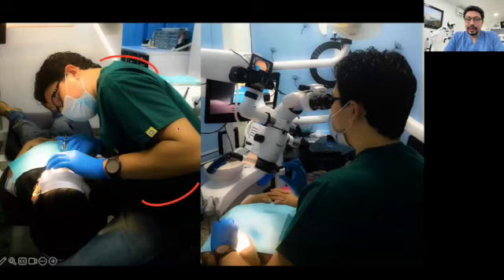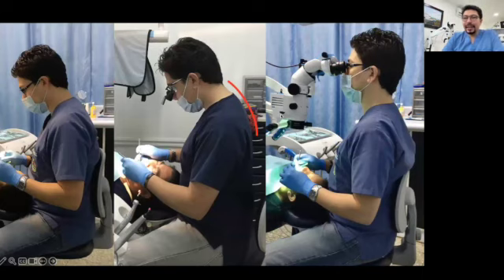See my position. I have this clinical position for applying anesthesia in the palatal zone in a little kid. That picture was taken like 8 years ago, maybe. And with the microscope, if you have the rotational extender accessory to your microscope, you can do the same. You can keep your binoculars in a straight, horizontal position, and you can move your microscope from side to side. You have a little bit more freedom of movement, but it's just a small extra freedom. It's not like with the 3D that you can move the optical pod in any direction.